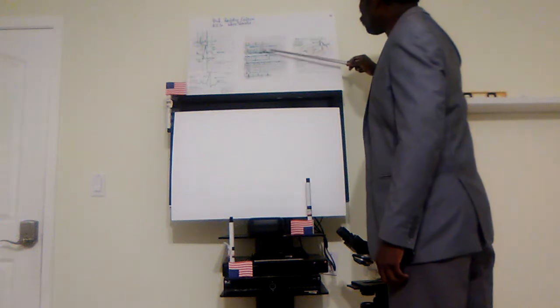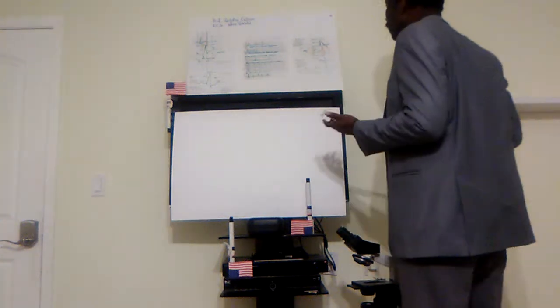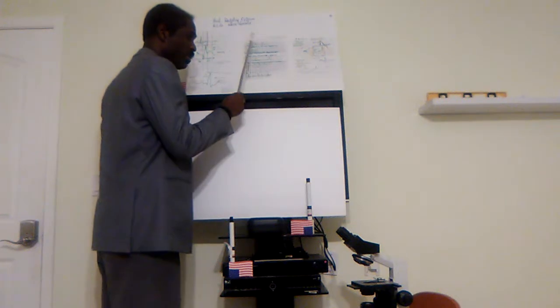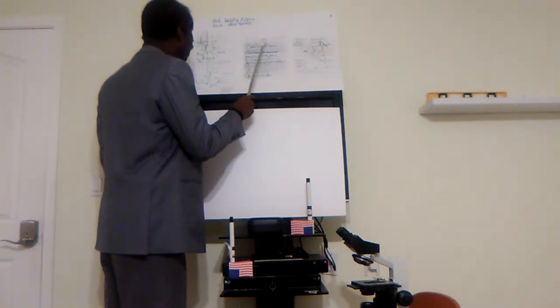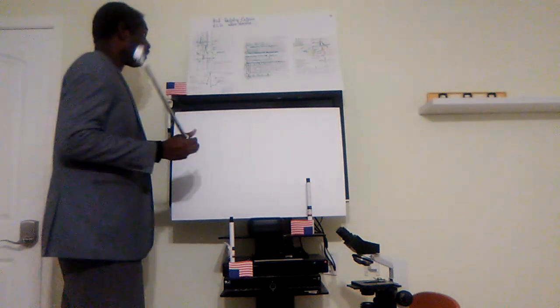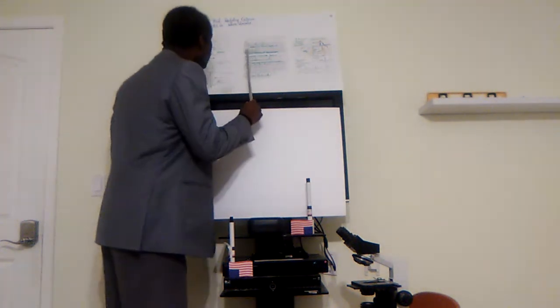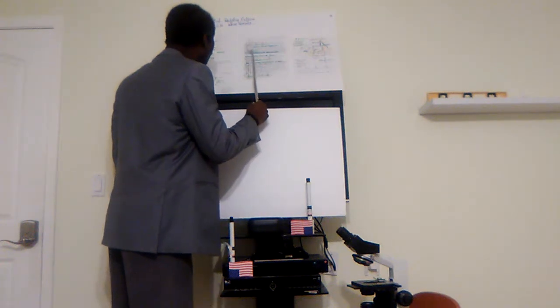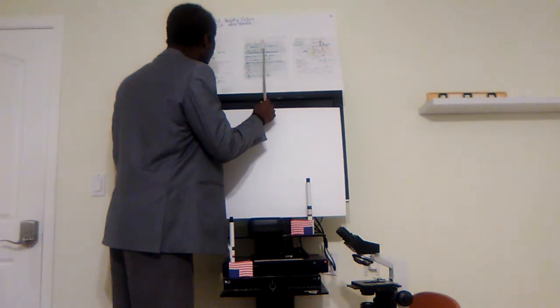Next over here, what we have now is some electrocardiogram signals. We have 1, 2, 3, 4, 5 representations of electrocardiogram signals, and we apologize for the small size of this signal that is not visible maximally for the observers. But here we have a normal sinus rhythm at the top, in this representation of ECG.